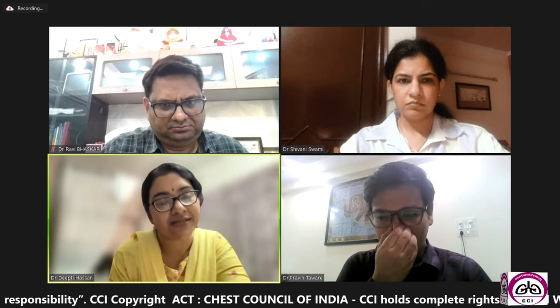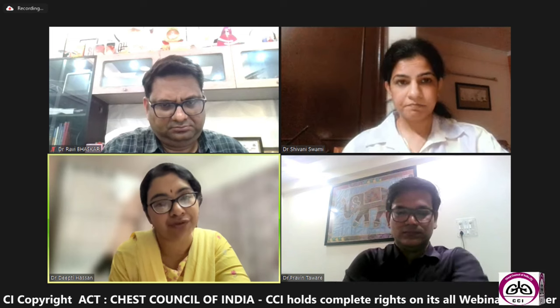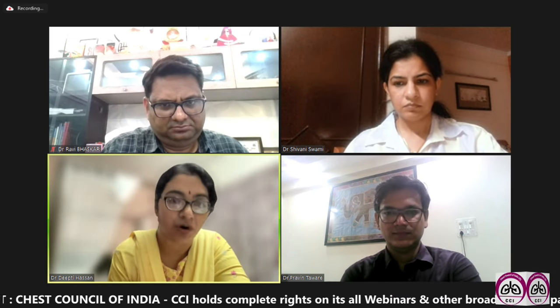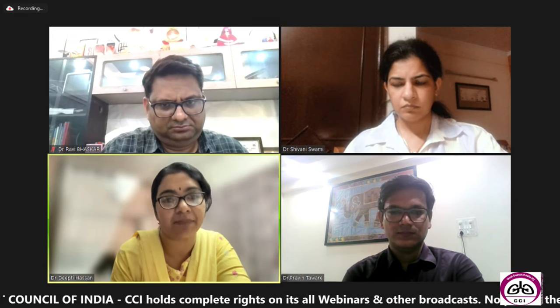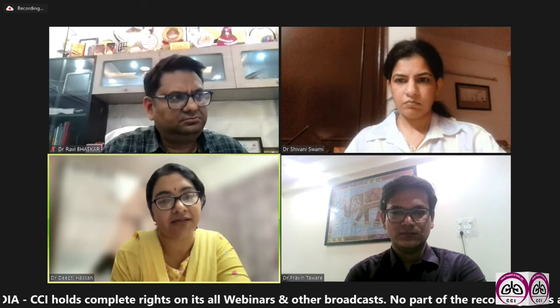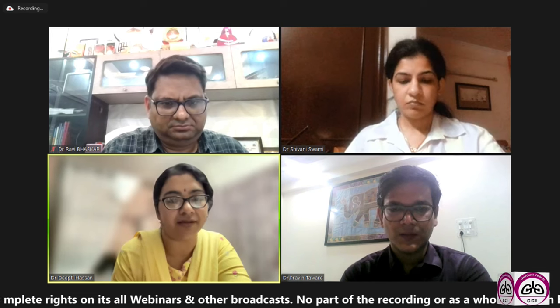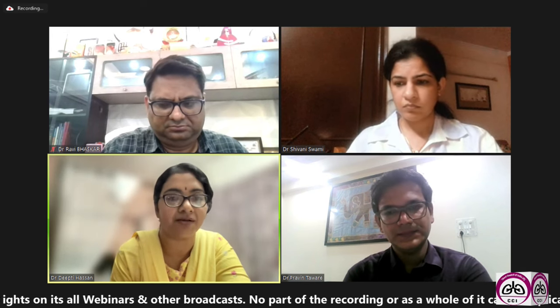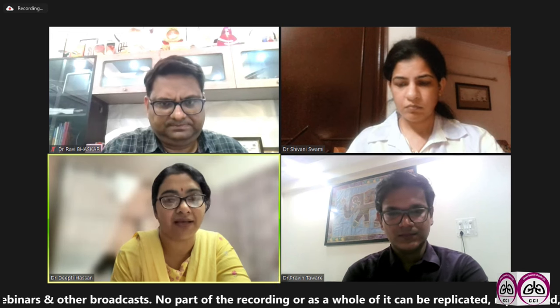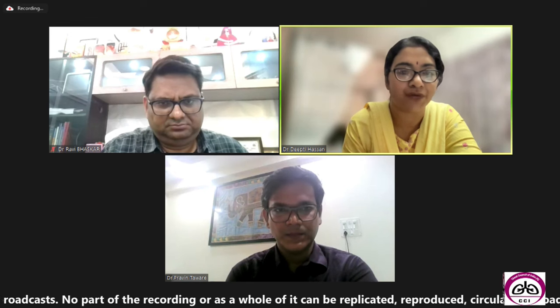So all this is also done in such a way that the information goes to the doctor who has prescribed that digihaler. So again, it is going to help the doctor also work up on the patient and makes his job easier. So apart from that, there are high advanced inhalers which even remind the patient to take the drug. So it is giving alarm to the patient that you have forgotten your drug and you are supposed to take an inhalation. So I think it's something very unique and something to look forward to.